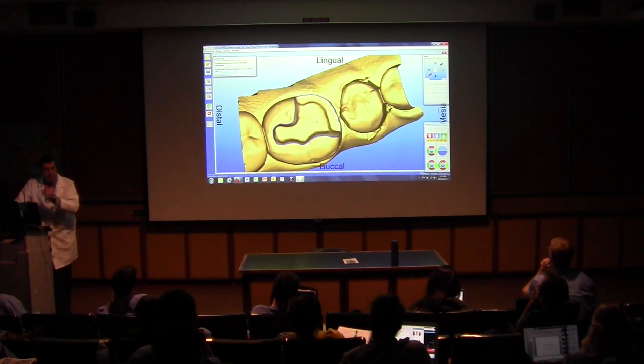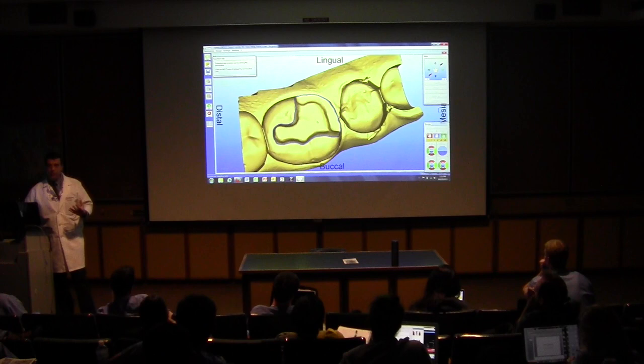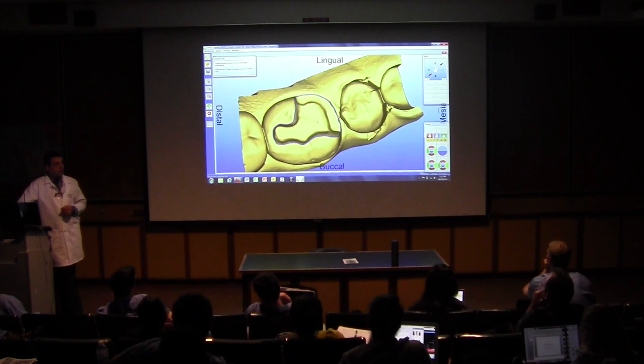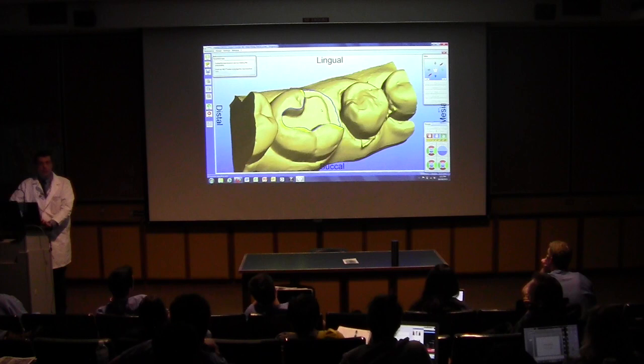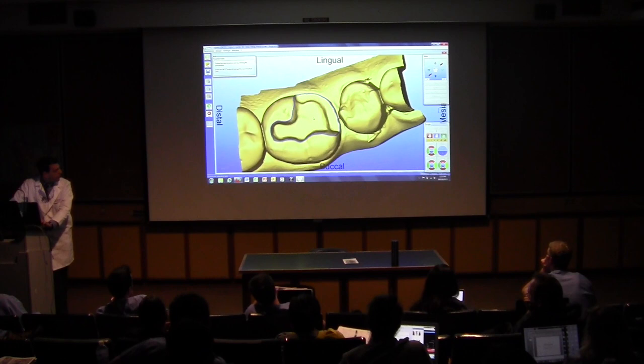The next step in this software is to define the insertion axis, or the insertion path. Why is this so important? Because if you have any undercuts, guess what? The machine will tell you. Let me rotate this prep a little bit here. Do you see some yellow spots there? It's kind of like a warning from the software: hey, wake up, you have some undercuts. So the software is asking you to rotate the prep in 3D in a way that you don't have any yellow spots.